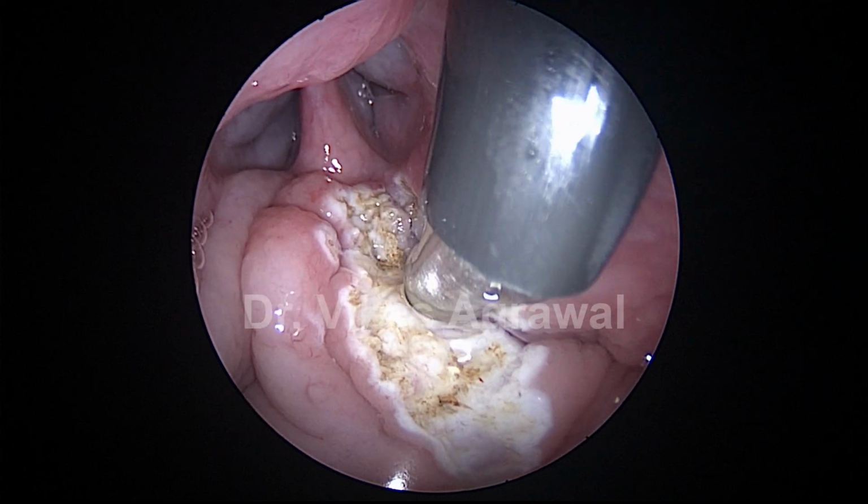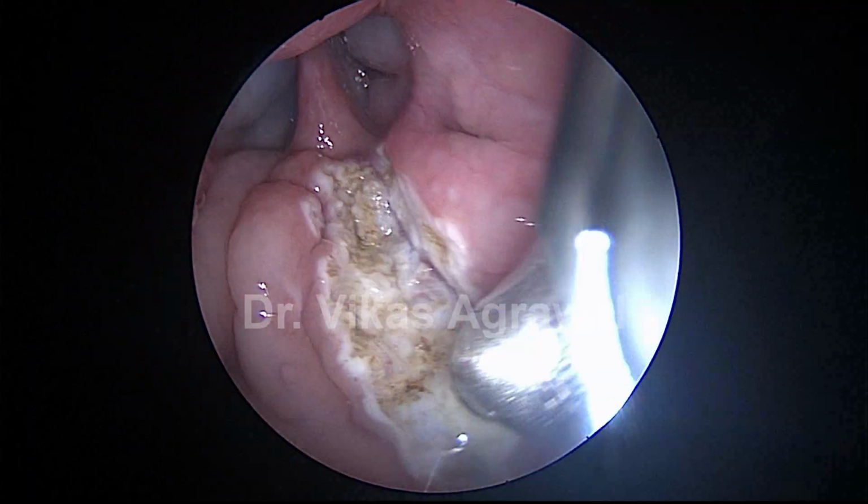The setting for ablation is 9, and that for coagulation is 4.